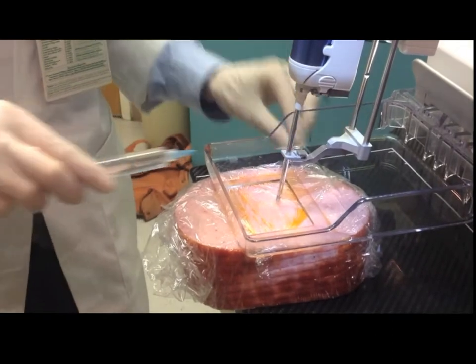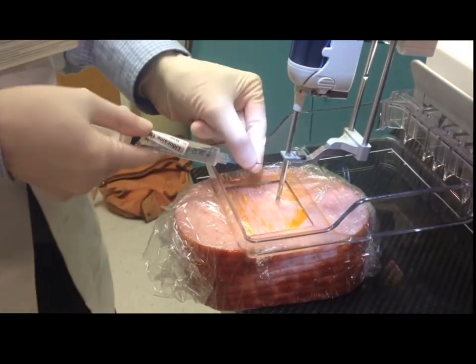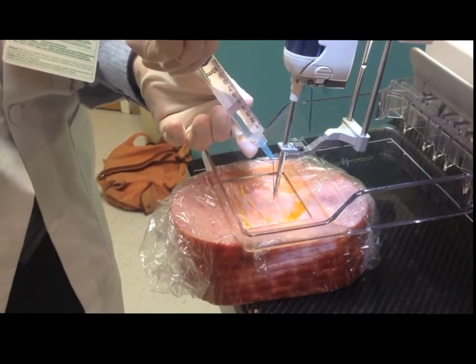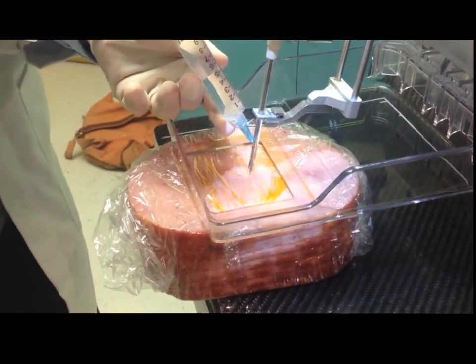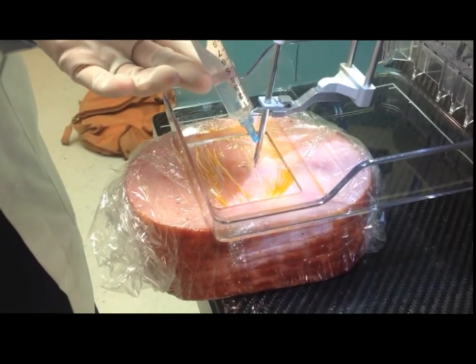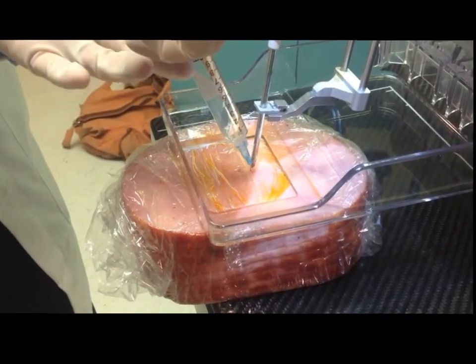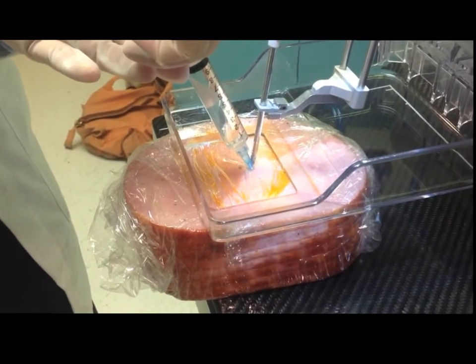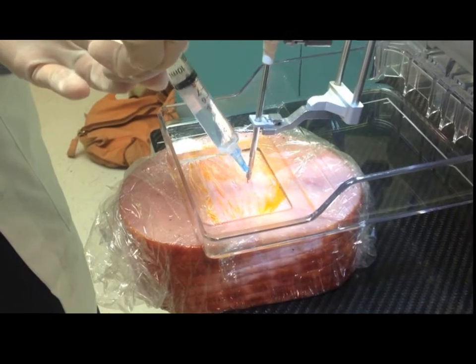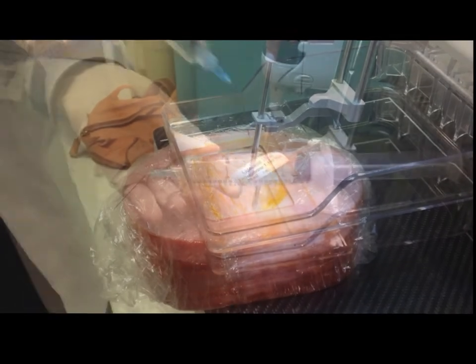We start by giving about 5 cc's of 1% lidocaine without epinephrine. We angle the needle as we find it helps us direct it appropriately along the track we want to use. You want to make sure you get a very nice subdermal bleb of anesthesia and then inject down from there to approximate target depth. Mary Mayhem here doesn't have a dermis but I think you get the idea.